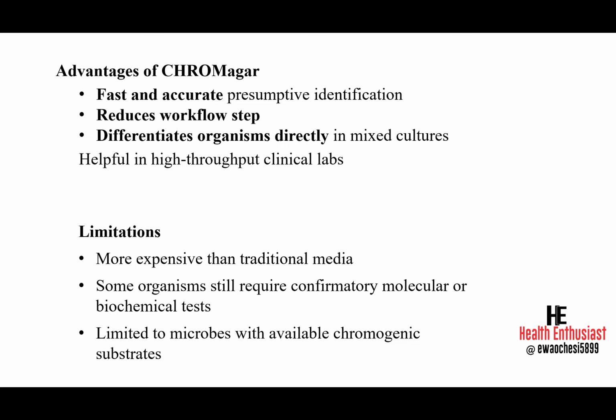Of course, CHROMagar media come with limitations. Like you talk about the costs, they are more expensive compared to traditional culture media. And many of these CHROMagar media may require confirmatory tests. Molecular identification is the gold standard we use in the laboratory.